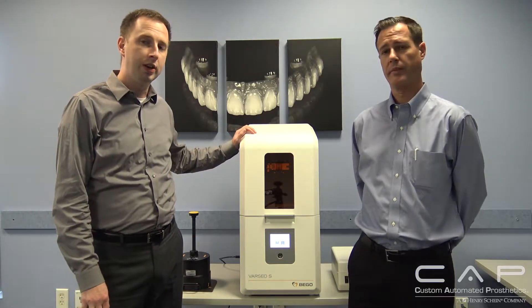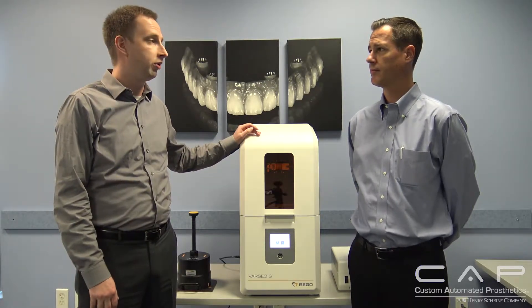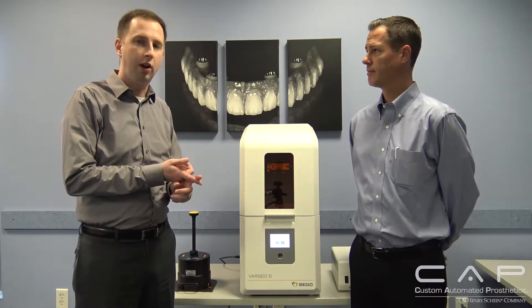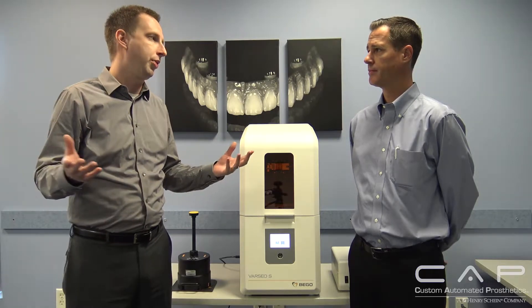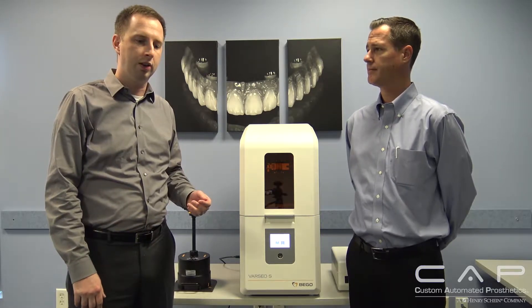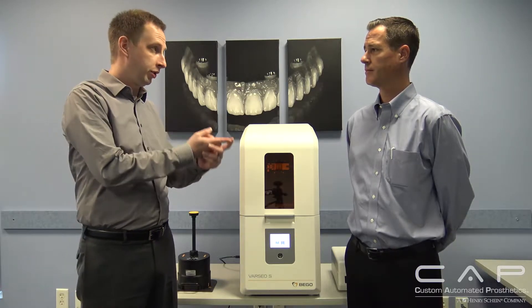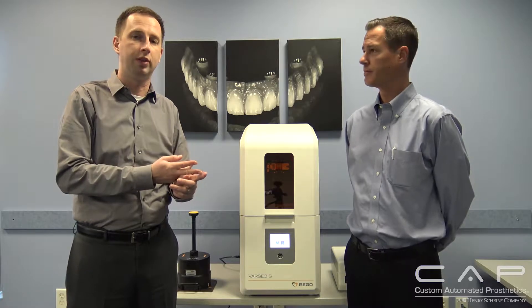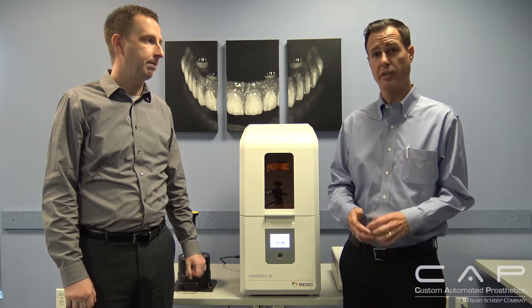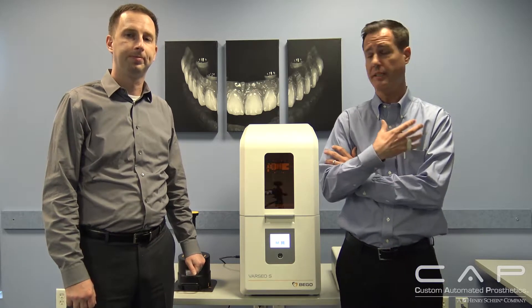It is unique in a couple of ways versus other 3D printers on the market. Bego, the company itself — and Jim can speak to this more clearly — is truly a dental company. This was developed from the ground up for dental; it wasn't some sort of third-party printer that's just branded or brought into dental. And it's a German company.